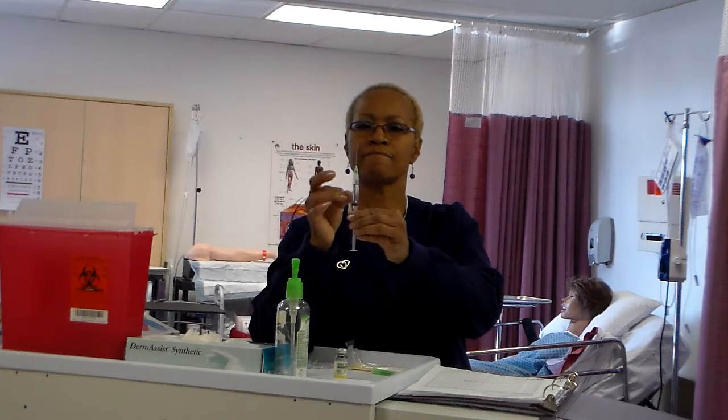If air bubbles are aspirated, do not expel air into the ampule. To expel excess air bubbles, remove the needle from the ampule. Hold the syringe with the needle pointing up. Tap the side of the syringe to cause bubbles to rise toward the needle. Draw back slightly on the plunger and then push the plunger upward to eject air. Do not eject fluid. So remove all of the air.